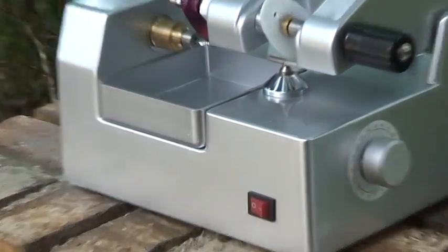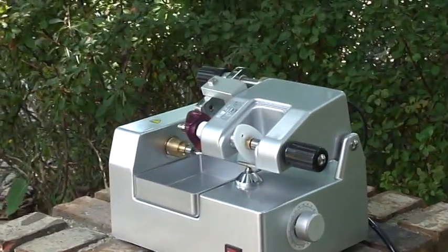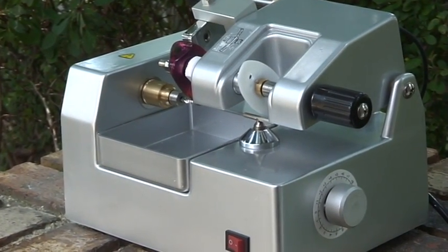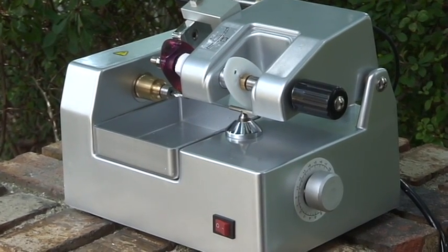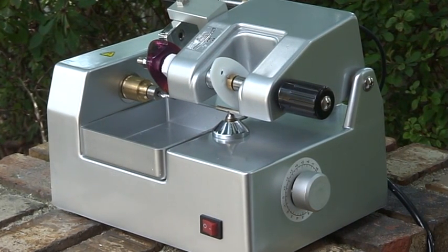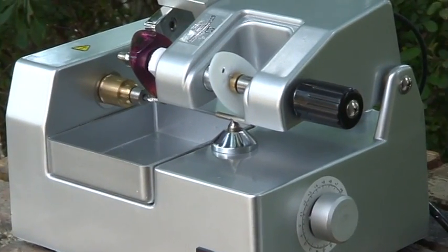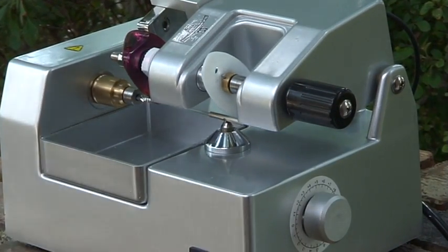You take that pattern and you put it in the lens cutter, and I've already got it set up. I've got an old XX, off-market, off-brand. I think it's a line gear, maybe. But going from an XX to a Juliet, you have to be really careful with your alignment, because the width of the Juliet is exactly the same width as the XX, and you're really just taking meat off the top and the bottom.